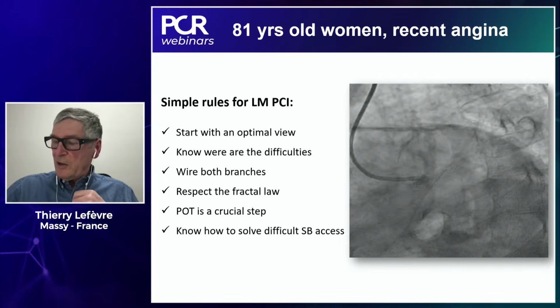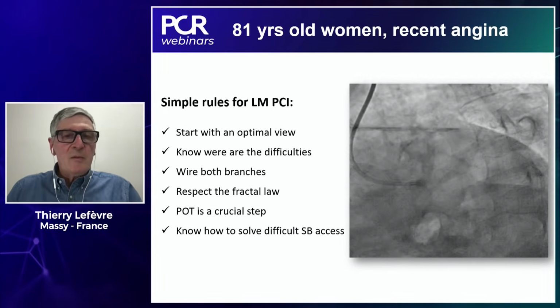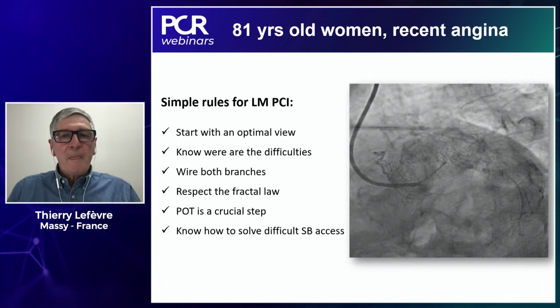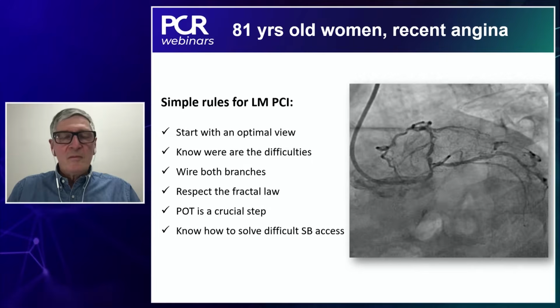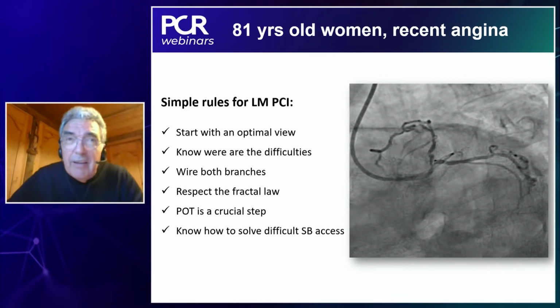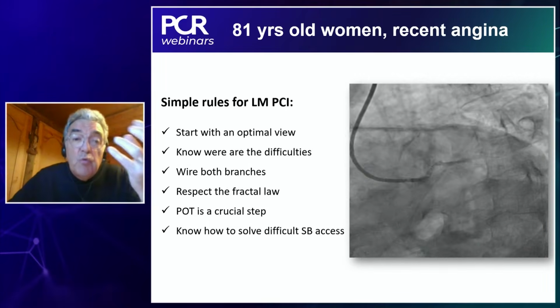So maybe we can discuss about this case before starting. I think yes. I have a question. You talked about, Thierry, the importance of having the right view of the left main bifurcation. So, what are the views that you use in daily practice?